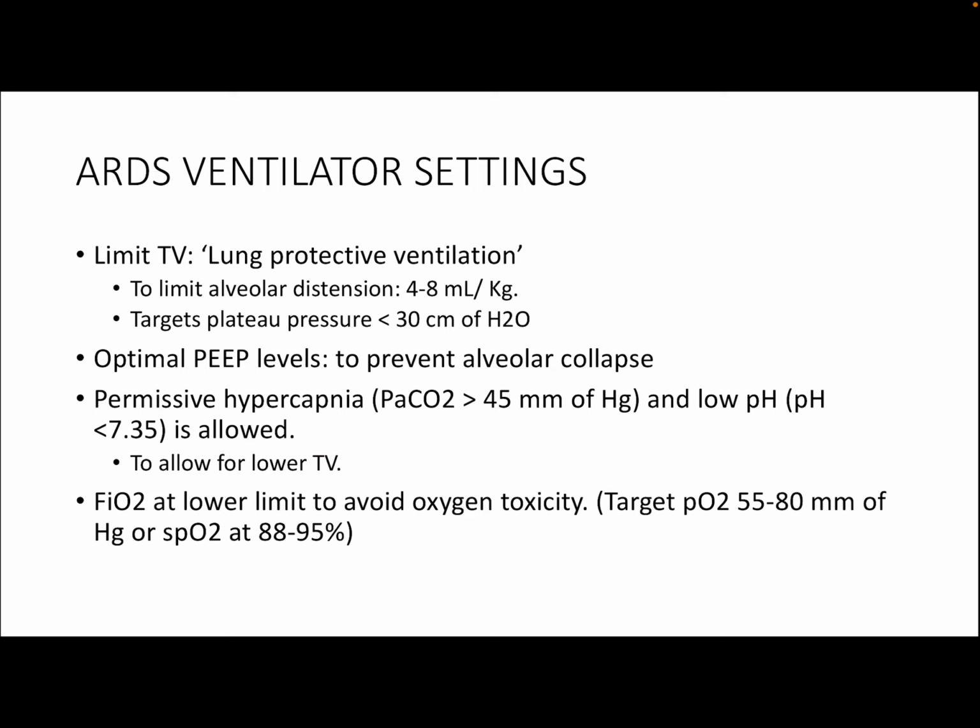Now coming to certain ventilator settings that we go for specifically in cases of ARDS. The first thing, limit the tidal volume, keep the tidal volume low. This is something called the lung protective ventilation or low tidal volume ventilation.